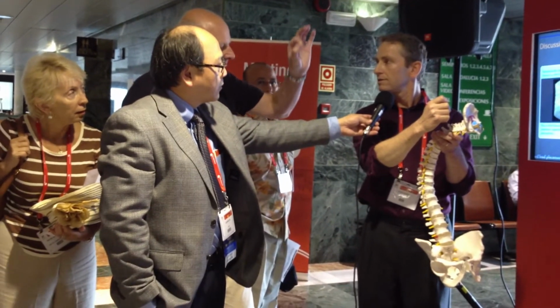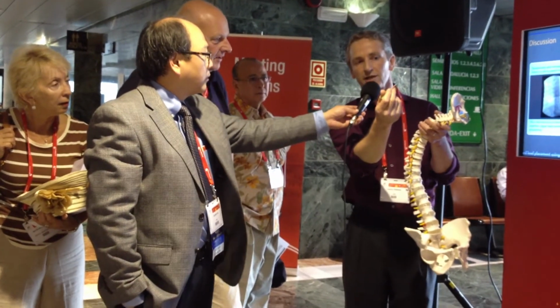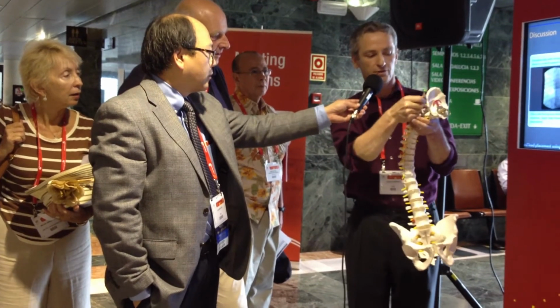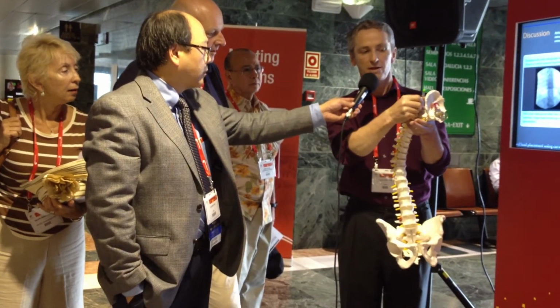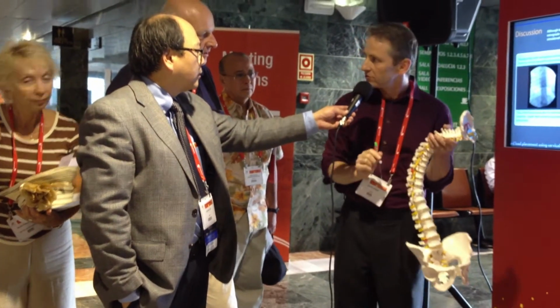Okay, and the lead has to make a sharp angle. That's why I use the Epimed 14 gauge needle. It allows you to push the needle tip up. So when you put it like this, you kind of help yourself to push the needle up so it goes to the posterior epidural space.